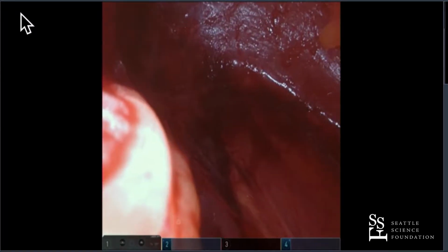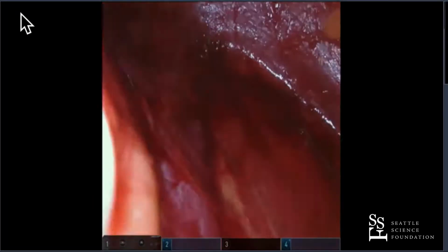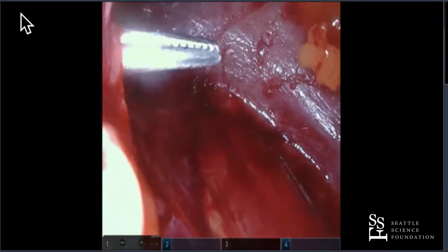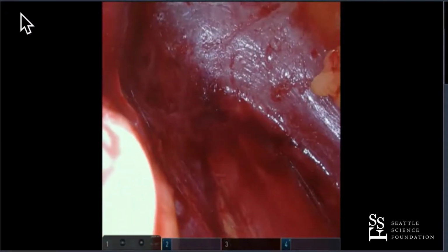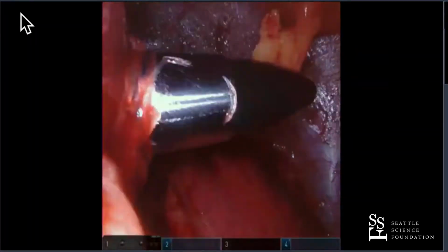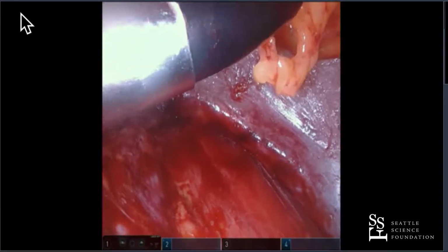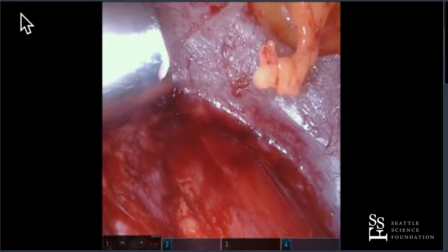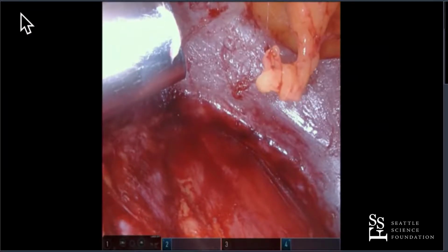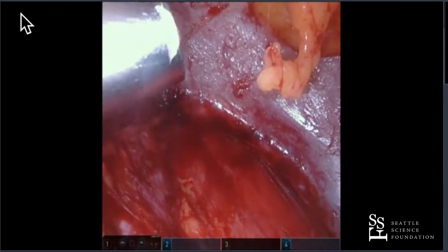So Jim, John is asking, is there a limitation to how much you can blow up that balloon? Because you told us in the lecture that you do like 50, 60 pumps. There's my tonsil. So again, I like to use a tonsil just to show me where things are going to come through. And I like to go underneath the 12th rib. The reason I like to do this under direct vision, some people will put a finger in here and do this digitally. I used to do that. That's actually the way I was trained when I learned this in Germany, when I did retroperitoneal surgery. The problem is you sometimes don't see the subcostal artery and vein, and so I've hit that a couple times, and that can be a real problem.